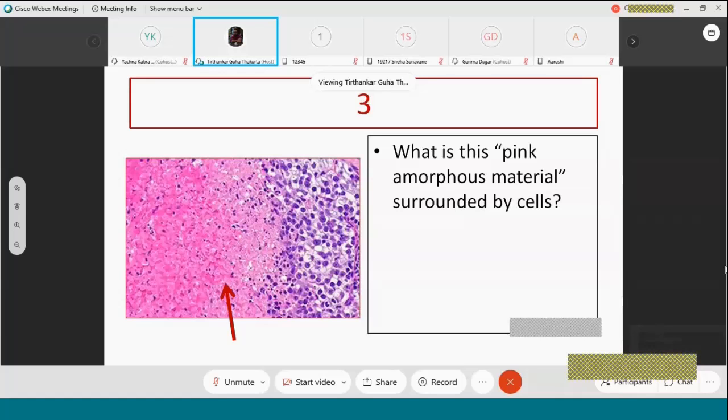So this is the typical appearance of necrotic tissue. When cells die, their DNA and other acids are denatured, so the cell becomes more and more eosinophilic. Cellular outlines are lost, making them amorphous. There is no nucleus or sparingly some damaged nuclei, and this is how necrotic material typically looks.